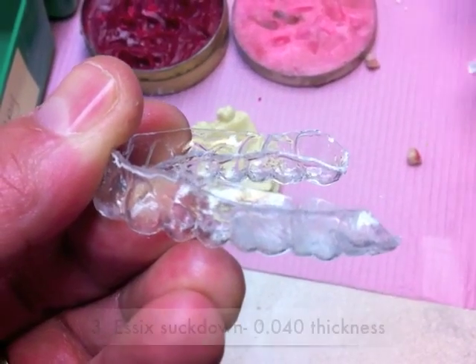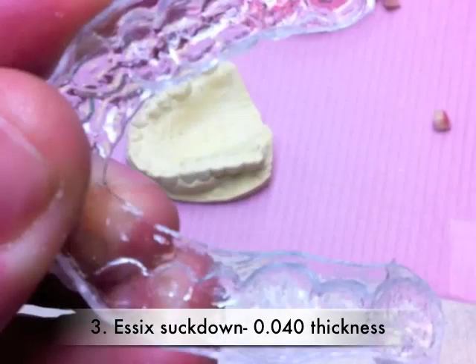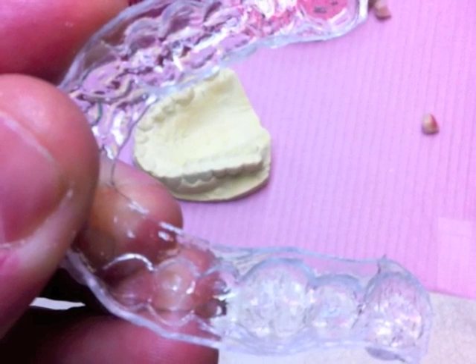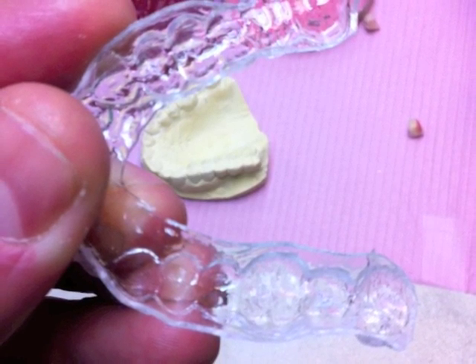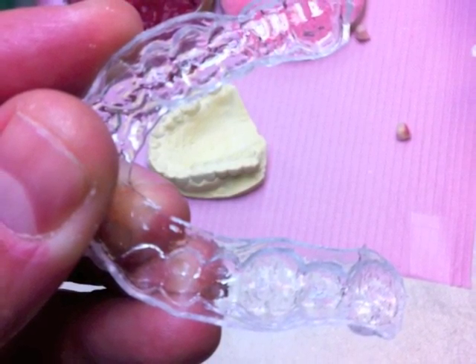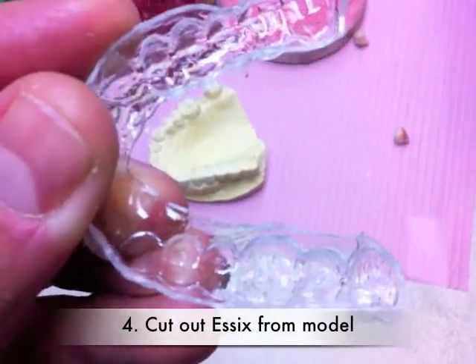Next, you can do a suck down with SX material. The 0.04 SX works best for this purpose as it is rigid enough to hold the material and sit with stability on the teeth. The SX is cut out and then finished to the gingival margins.